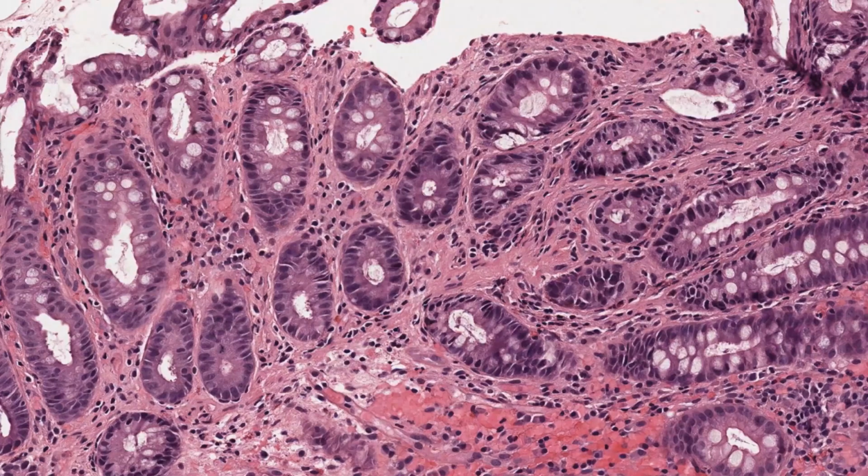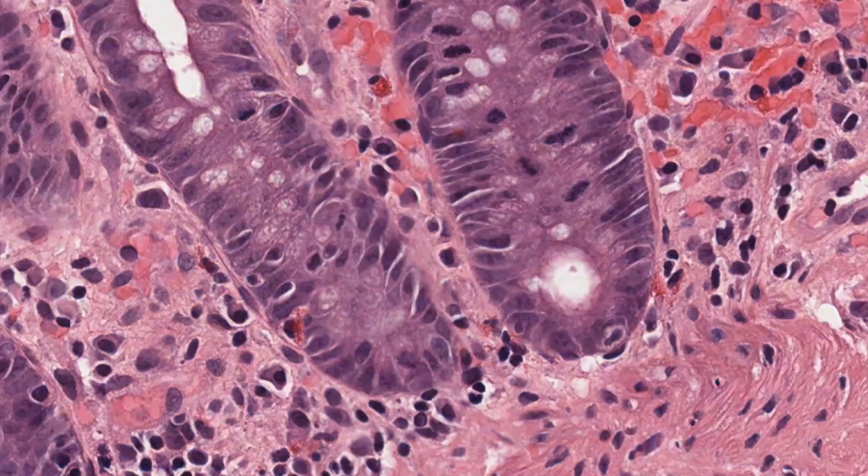There is no basal plasmacytosis, as we will be looking for that constantly. Now, I cannot see any acute inflammation in this field. So far, I am just looking with you here. This is the base of the crypt. Yes, maybe 1 or 2 plasma cells are trying to trickle down, but they are not clustering.